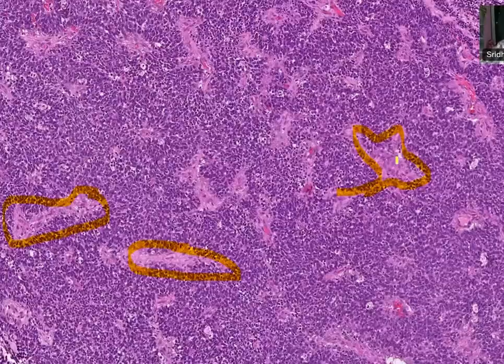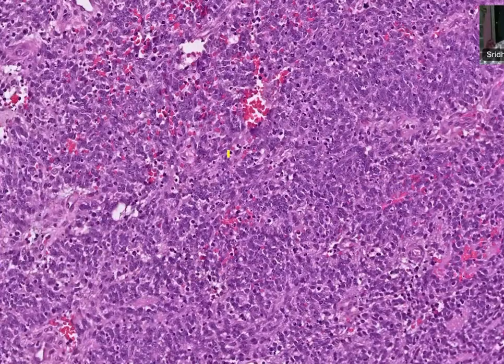Now how will you describe this cellular area? The cellular areas show tumor cells which are small in size. What are these dark dots? Sir, these are mitotic figures. These are apoptotic bodies.